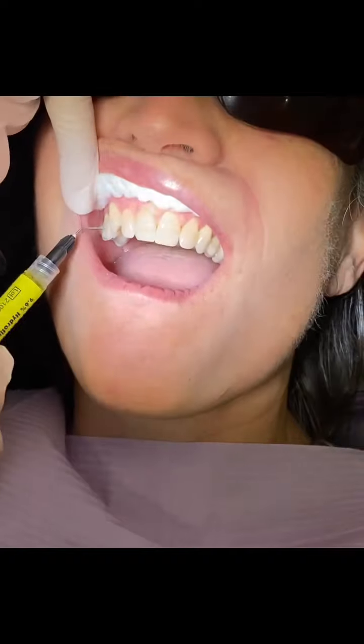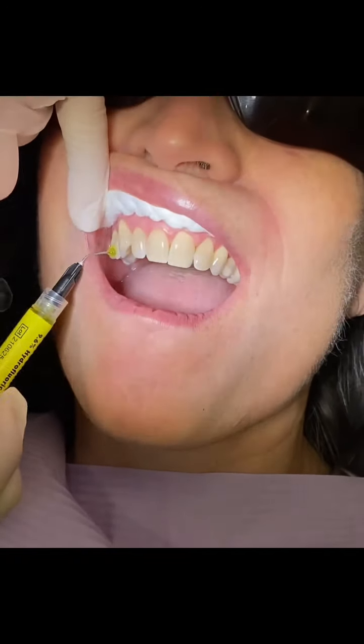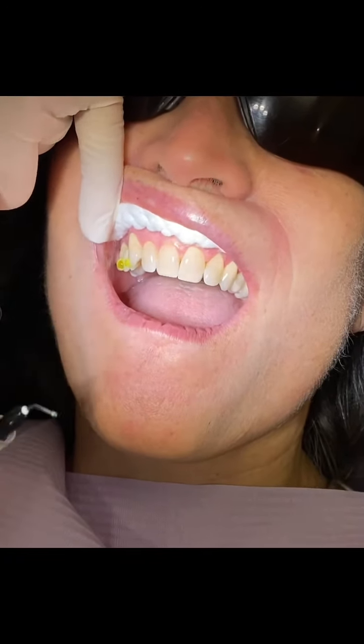Some of the teeth have porcelain, and we use a porcelain etched gel on those teeth. The teeth without porcelain, we just use a regular etch.